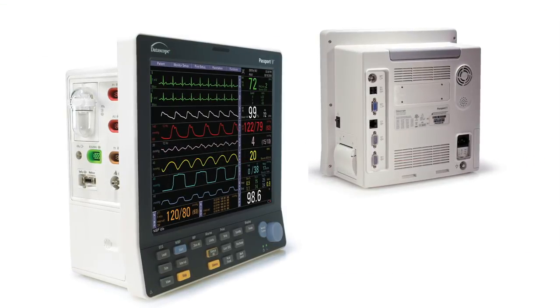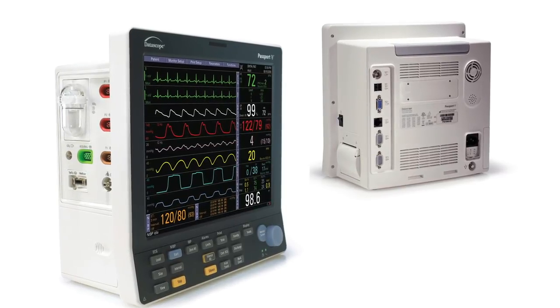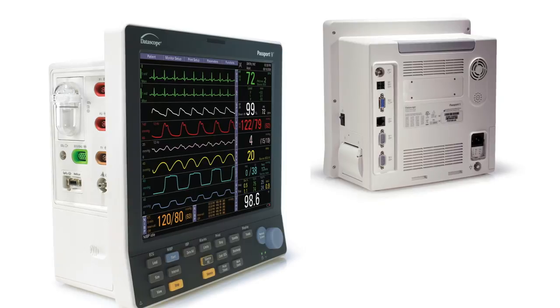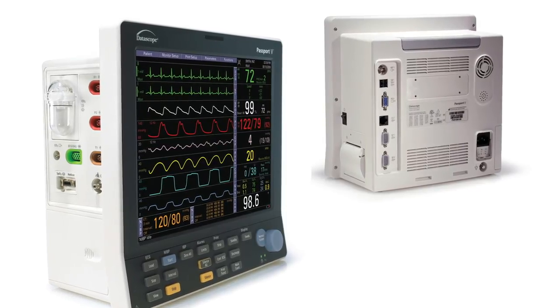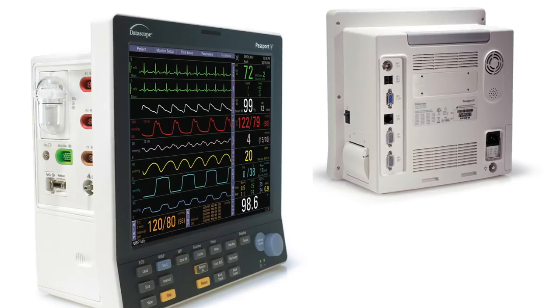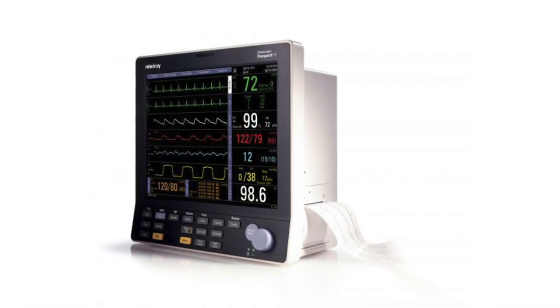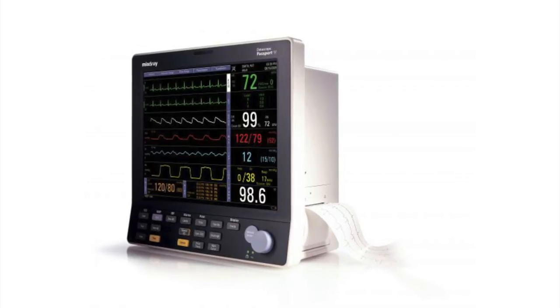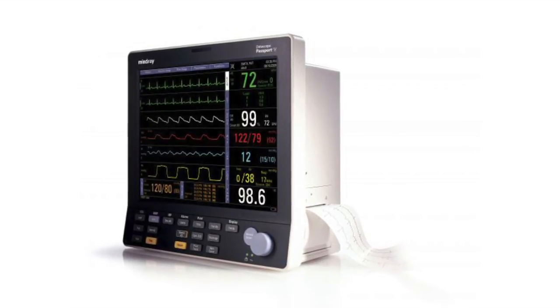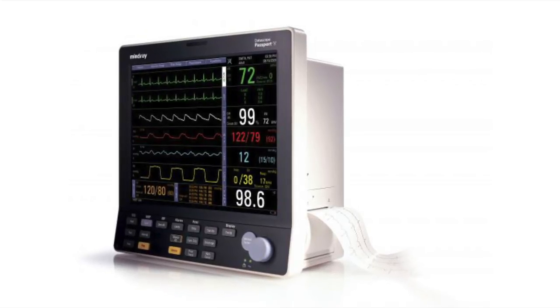The Passport 5 is MindRay's latest addition to a long line of portable patient monitors designed to meet the needs of caregivers in a range of clinical areas. The Passport 5 is built on a solid foundation of experience and knowledge. It follows a proven approach to acquisition and presentation of patient data, thereby delivering impressive reliability and performance.